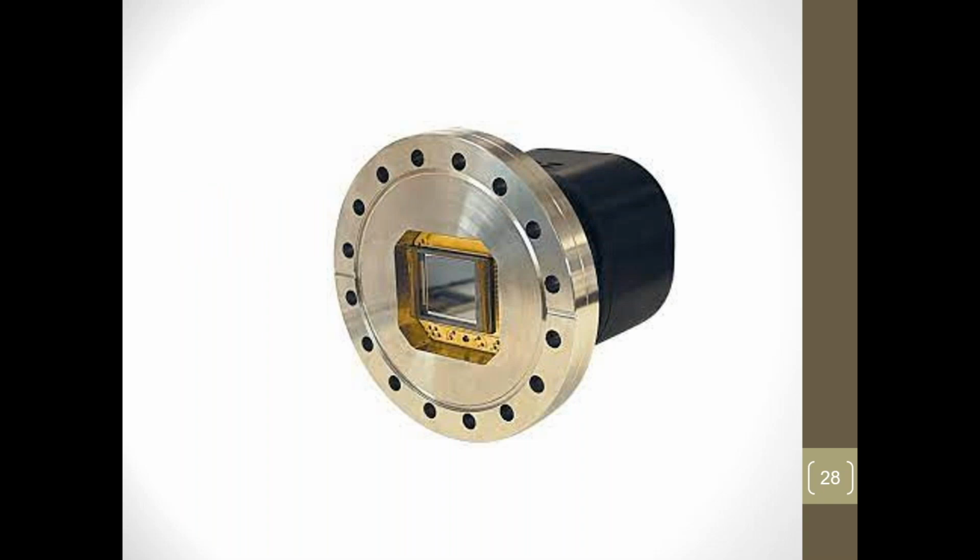And if you still have any C-arms that aren't digital, that are analog, still kicking around in the OR, they'll have this CCD camera in them. I can't think of any of them having pickup tubes anymore. So like I said, if you've got an old 9800 or 9900 kicking around in the OR, this is the type of camera that it would have.